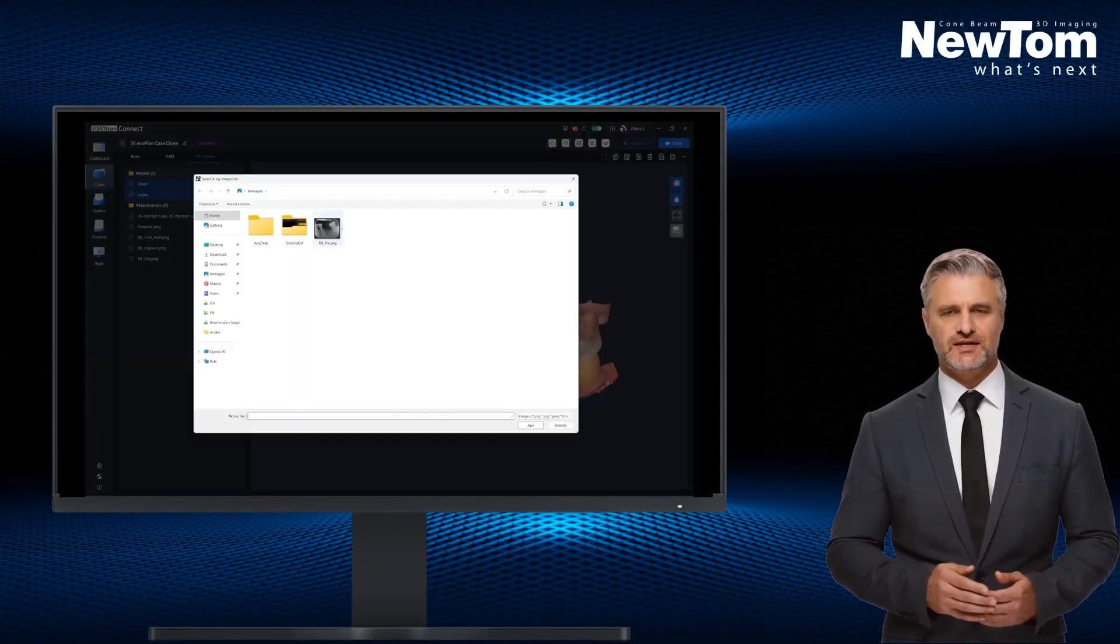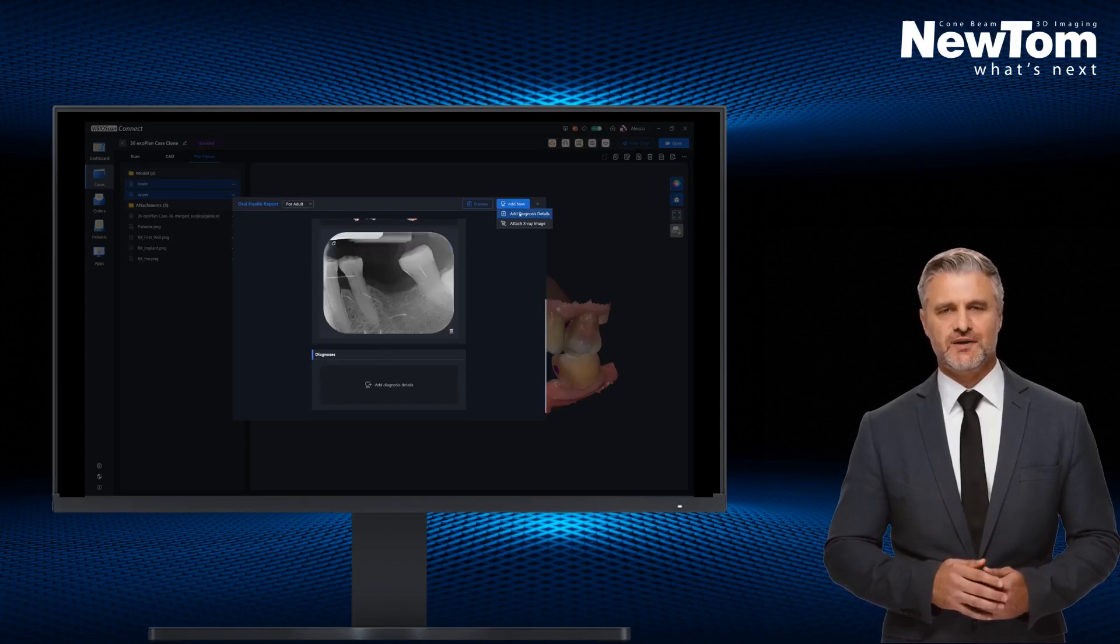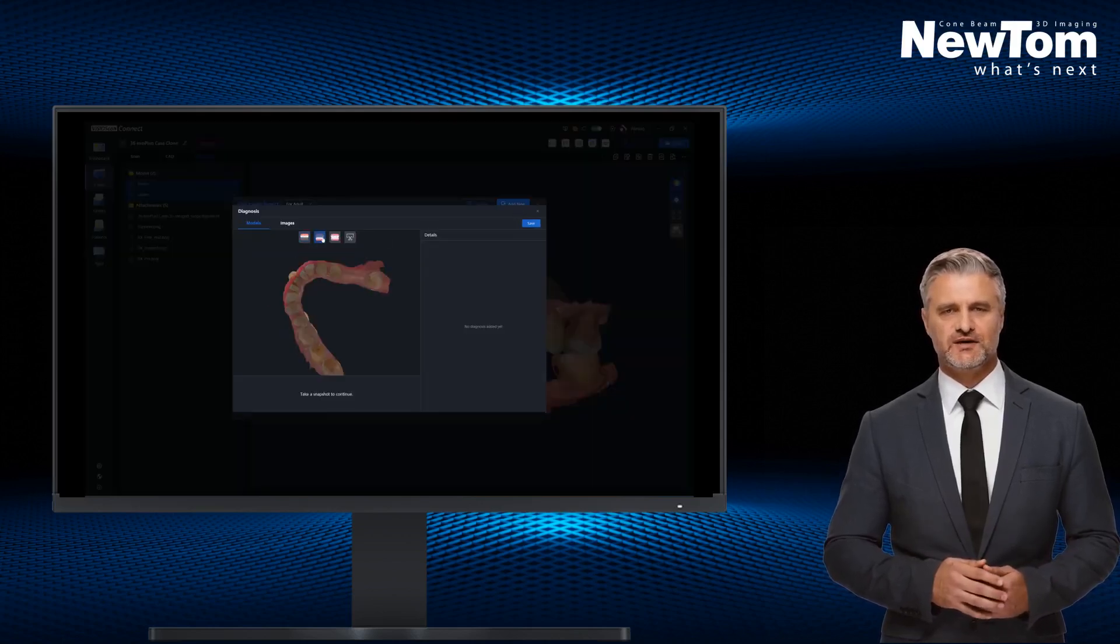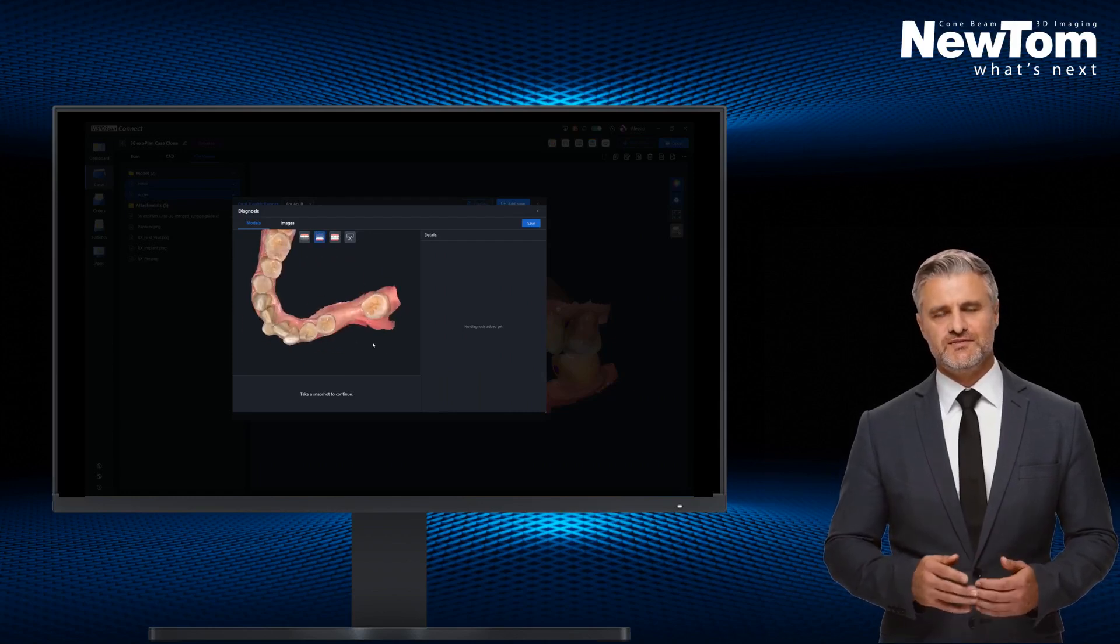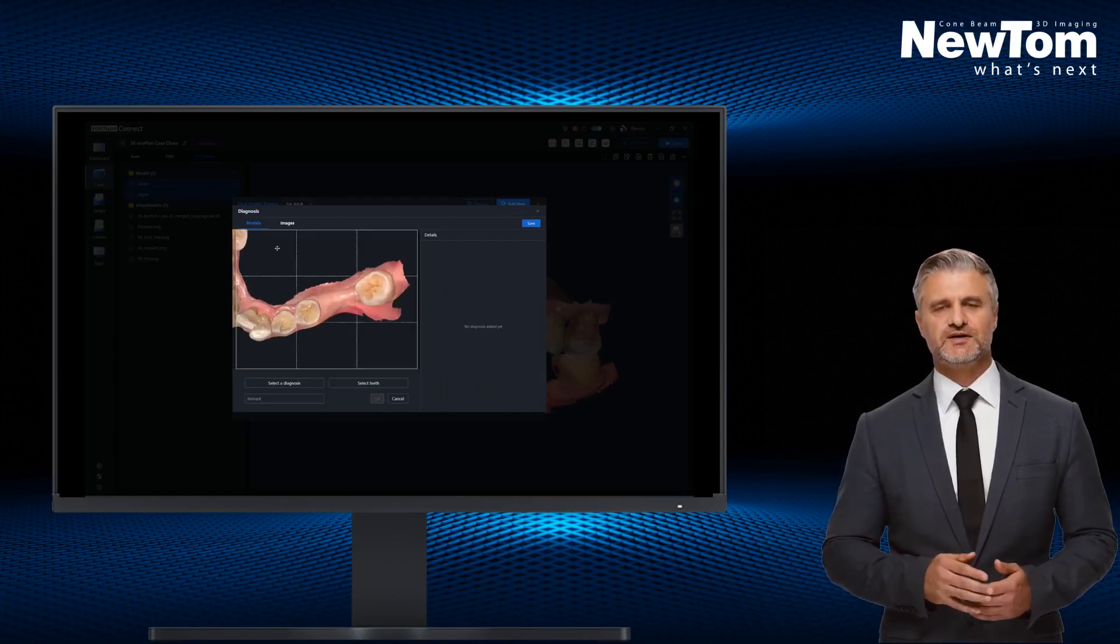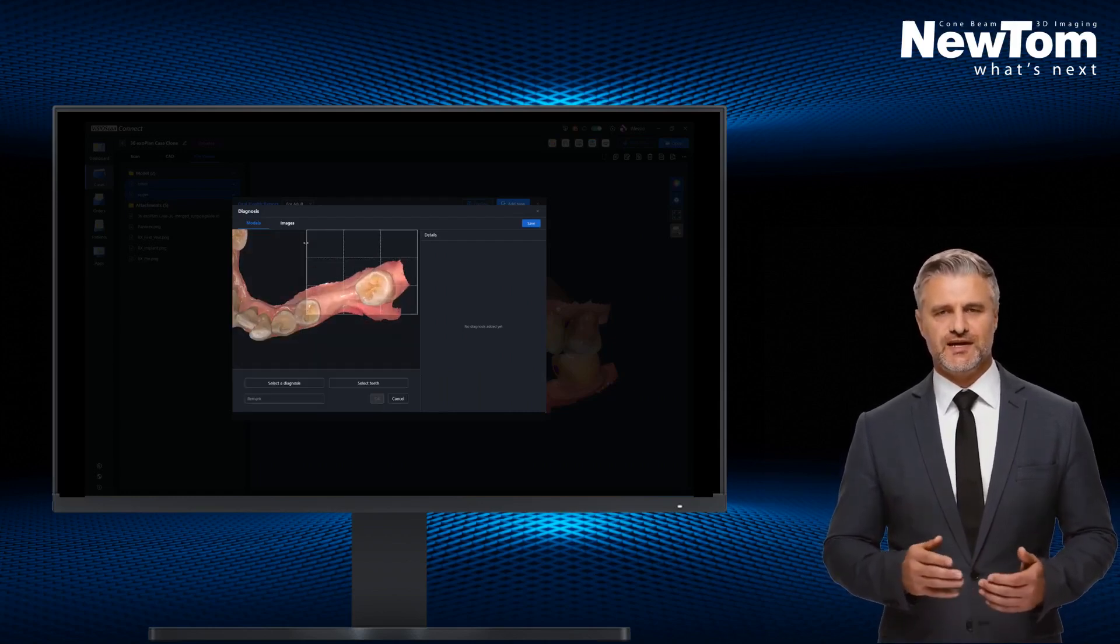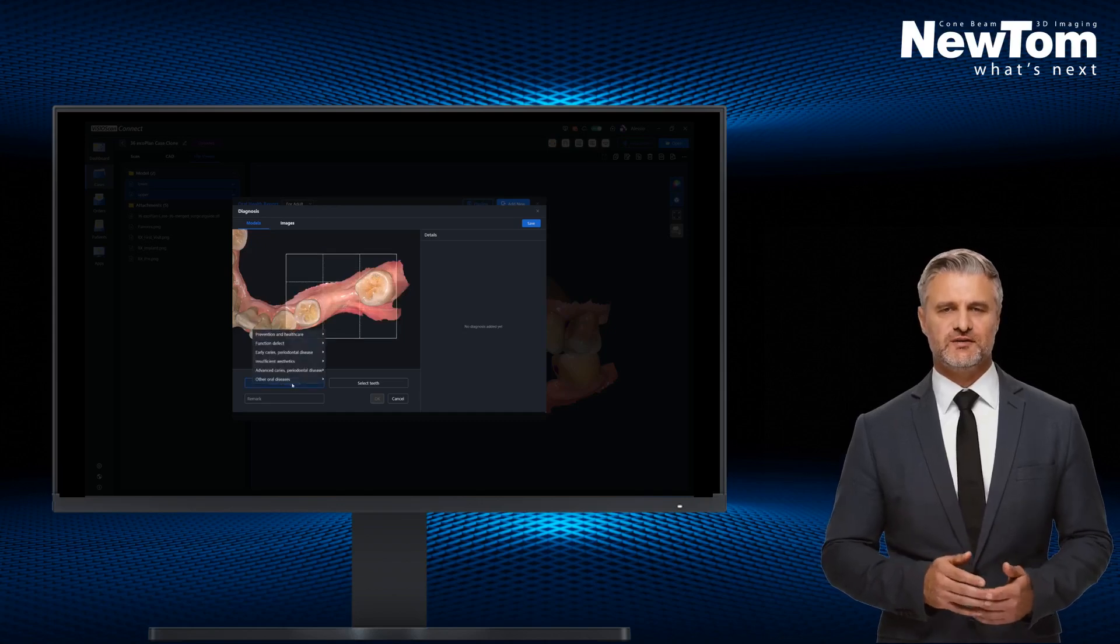Now we can insert X-rays or other images into the archive by activating the Add Diagnosis function. Next, a region of interest can be selected, the element marked, and a pathology associated.